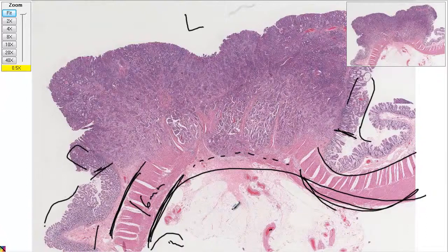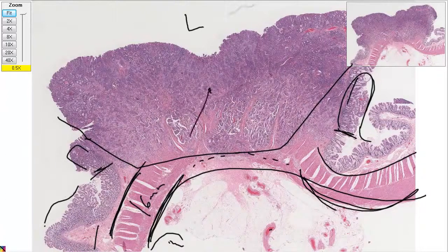So now this is where we have the cell dysplasia. This is all the bad stuff. It basically started probably somewhere up there and is invading in all of these directions. Just one cell up there started dividing uncontrollably. That's right, it could have started from one cell being very bad.